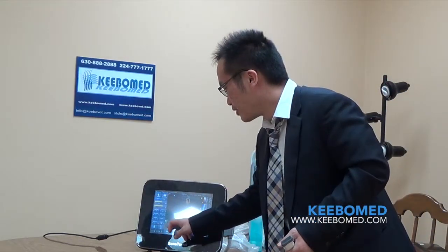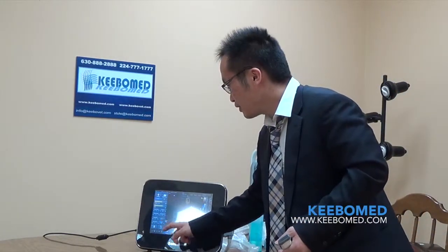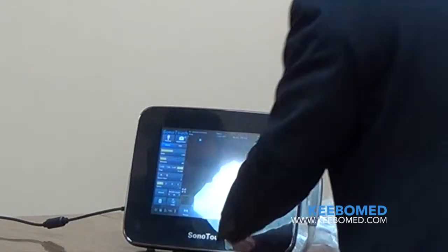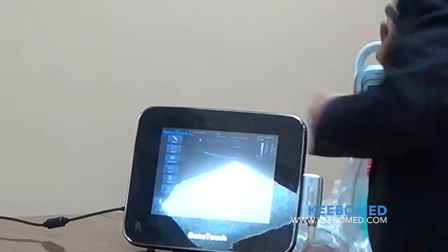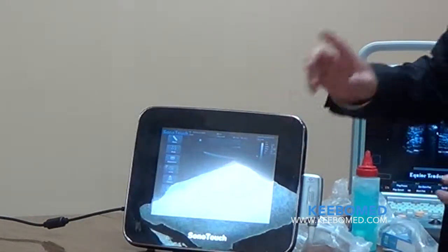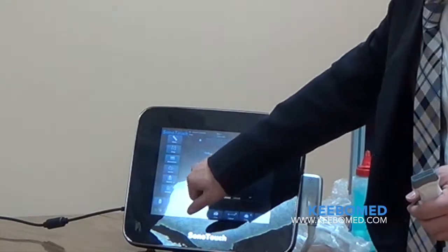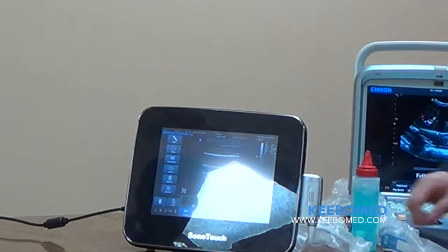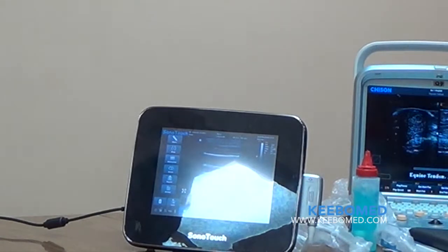Now we can save pictures, and we can also save the cine memory. The picture will be saved — you just click it to record the image. You can also get a movie clip. You can play the movie through the menu, or play it automatically by touching the screen. If you want to stop it, press again. You can also play it back.